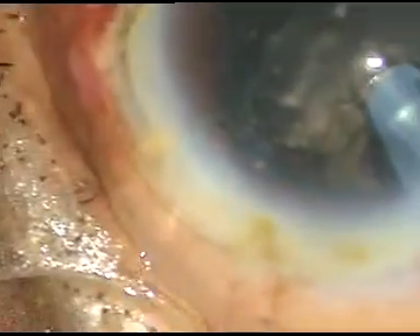Dear colleagues, we need to be patient. We cannot hurry up in such cases. We have to protect the intraocular structures very nicely. In this case I have started emulsifying from the apical side of this fragment, because the apex is sharp.